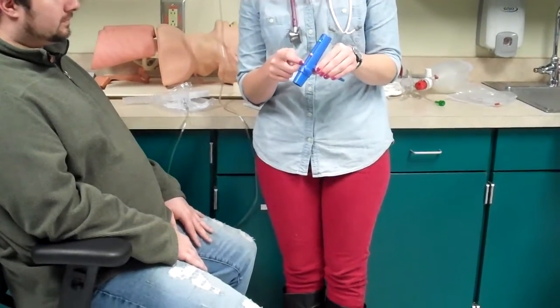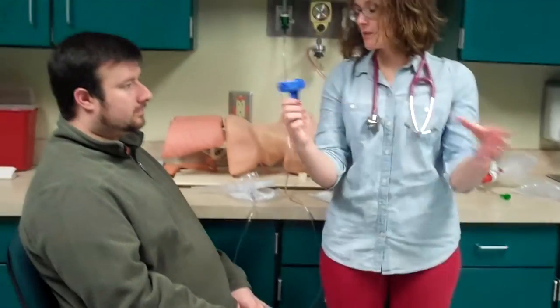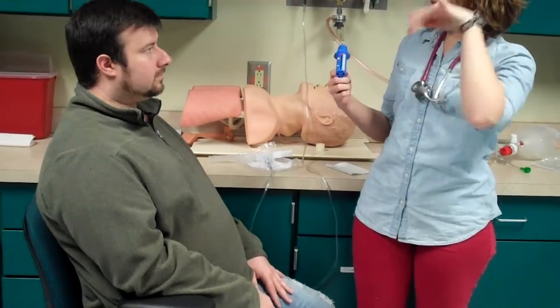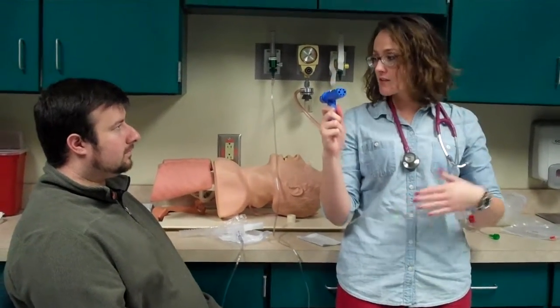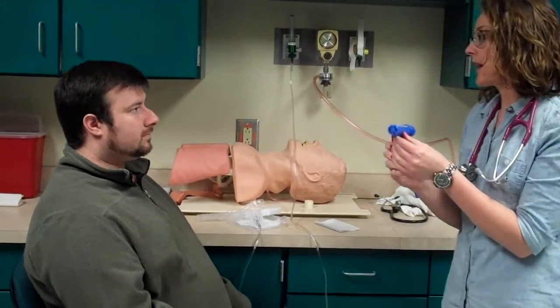So I'm going to pull this red thing down, and you're going to hold it like this in your hand, whichever hand's more comfortable for you. Make sure your lips are around it, your tongue's on the bottom. Bite down is probably the best thing to help you. You want to make sure you try to stay straight. If you need me to hold your shoulders back, that's fine. You're going to take a deep breath in, and you're going to blow out the best that you can without going forward, okay? We're going to do this 3 times, okay?